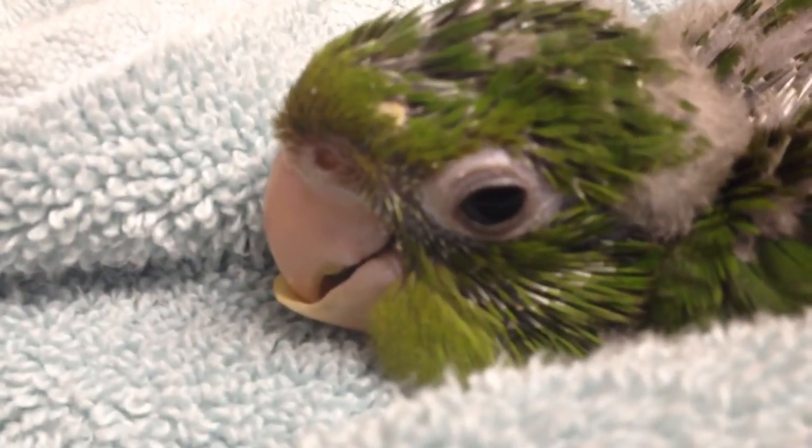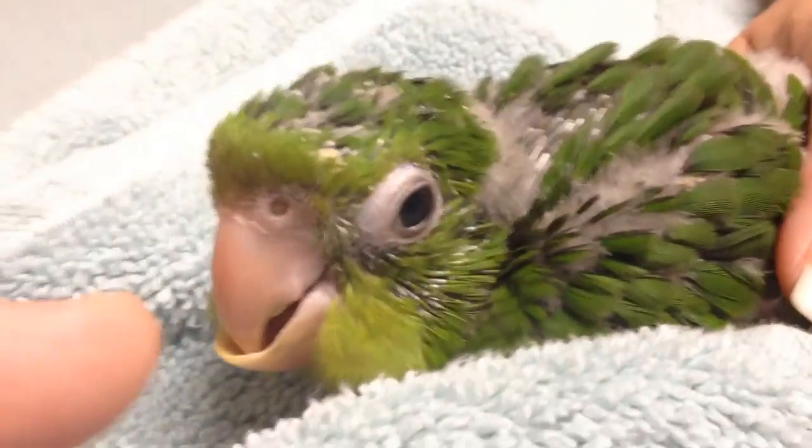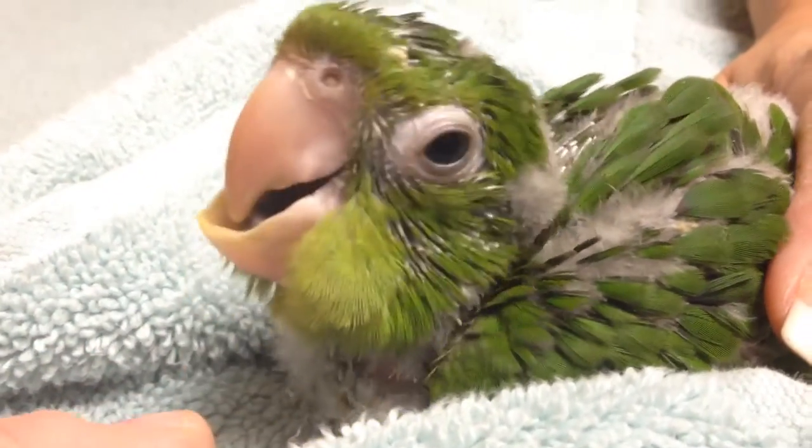Here we have a cute little conure with mandibular beak overgrowth. We're going to trim the bottom beak a little bit and try some non-invasive physical therapy for about two days. If that makes a difference, Mom will save herself some money. If not, we'll have to do some minor surgery and actually build the upper beak up enough so the bottom beak will stay in place.